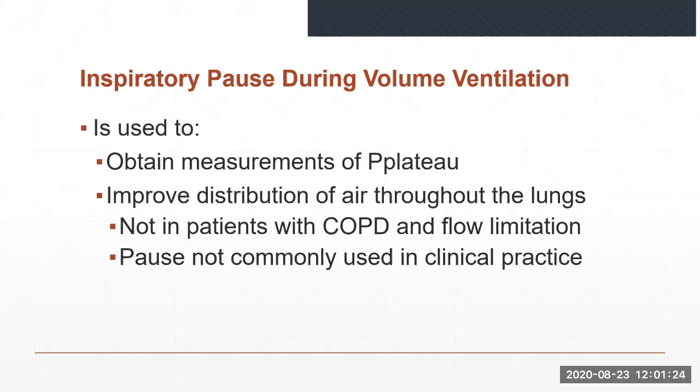Inspiratory pauses can also be selected for use with each mandatory breath to improve the distribution of air throughout the lungs, regardless of the type of flow pattern used. It is believed that an inspiratory pause provides a longer inspiratory time, which in turn provides optimum VQ matching and reduces dead space to tidal volume ratios.